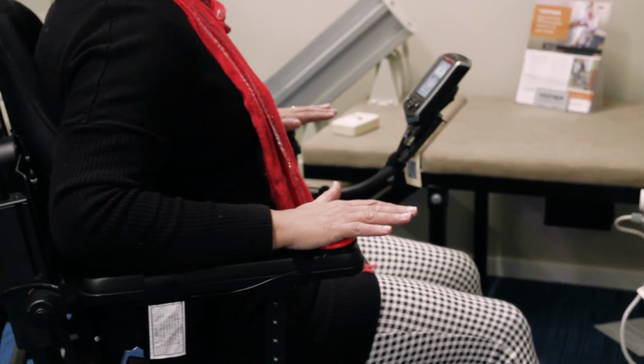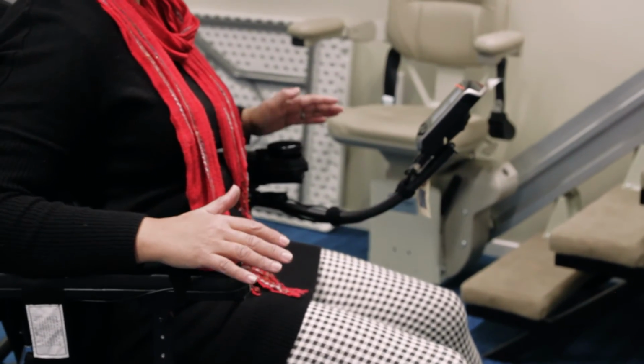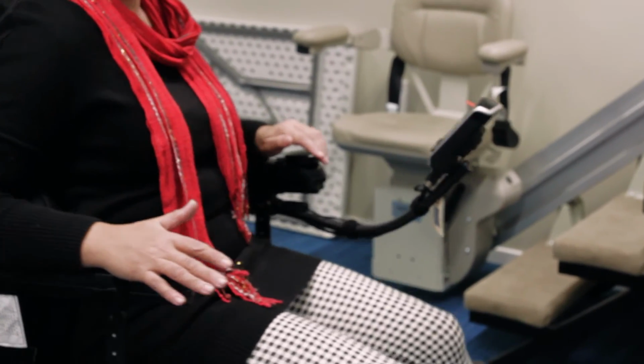The link driving, I think this is fairly new here. We've got the Q6 just set up with it, and basically you have two buttons. If you hit the right button, you go right. If you hit the left button, you go left. Hit both together, you go forward, which is actually a nice instinctive way of driving and quite a nice setup. Currently it's set up through iDrive, but certainly get in and have a go. I actually quite like this driving style. It's something nice and easy.